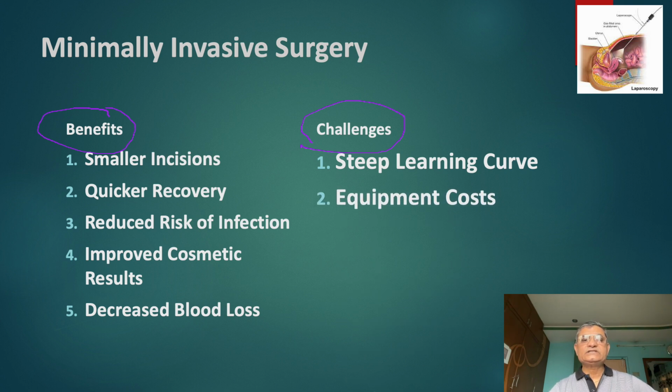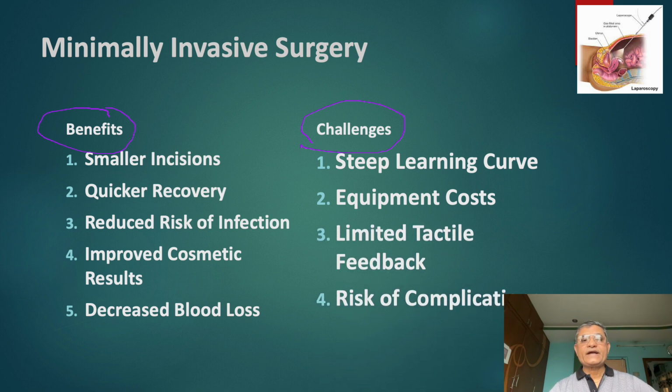And the challenges are steep learning curve, equipment cost, limited tactile feedback, risk of complications, and lastly, the patient selection. I think we learned minimal access surgery very well.